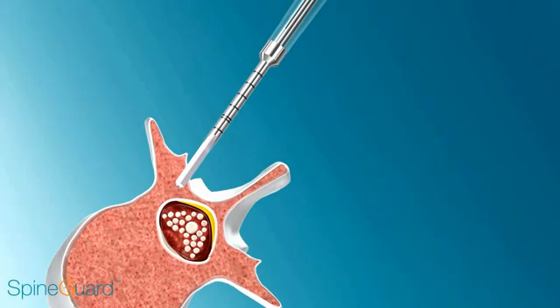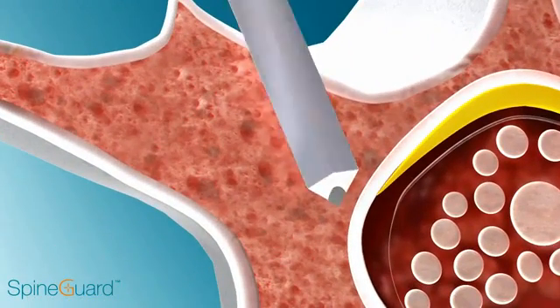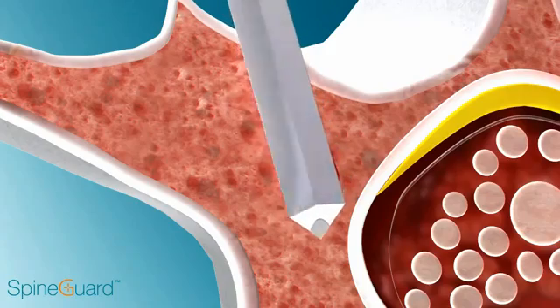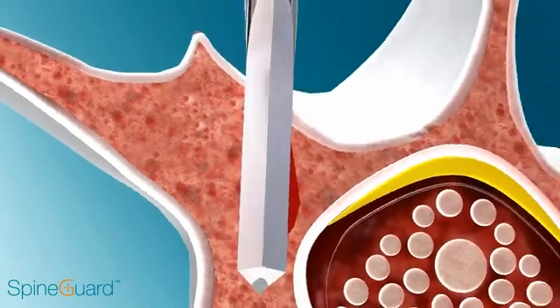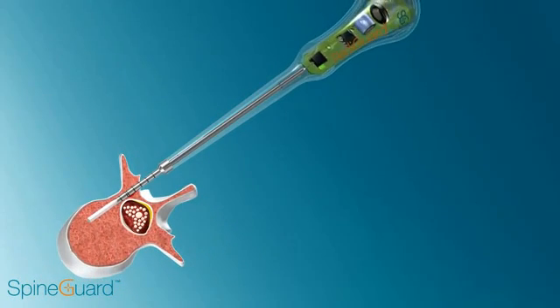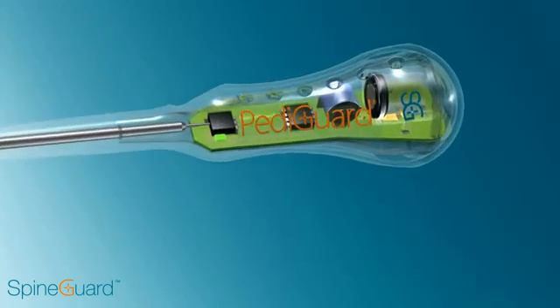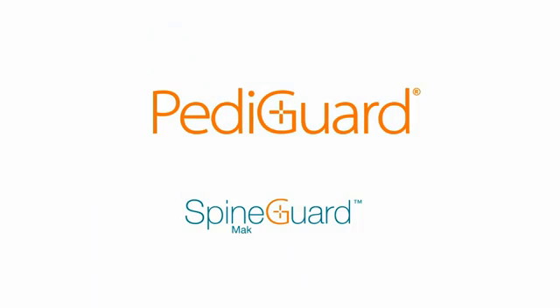As Pediguard detects cortical bone, the surgeon can slightly redirect and resume drilling. With its bipolar tip and microprocessor, Pediguard is placing navigation back in your hands.